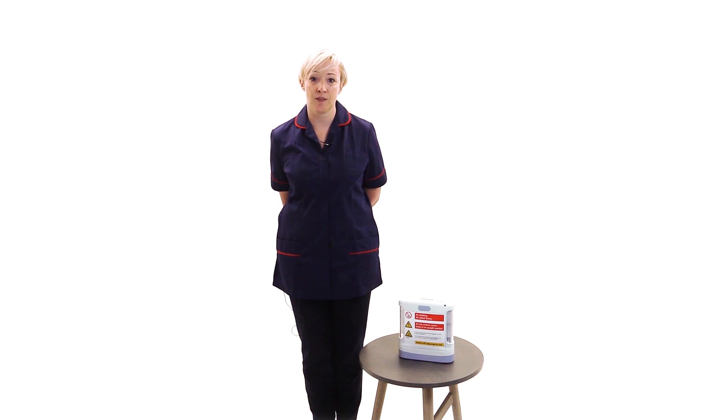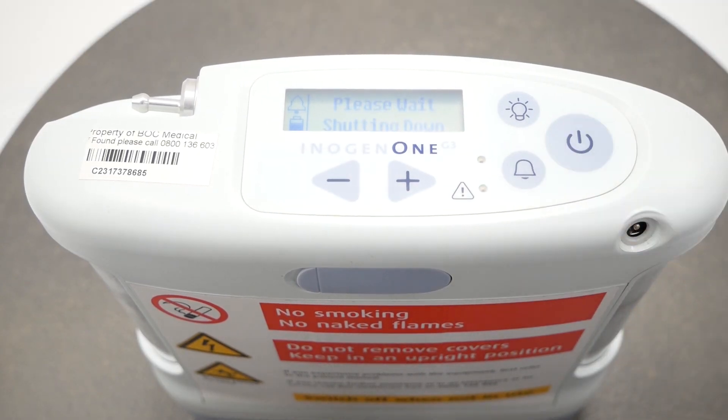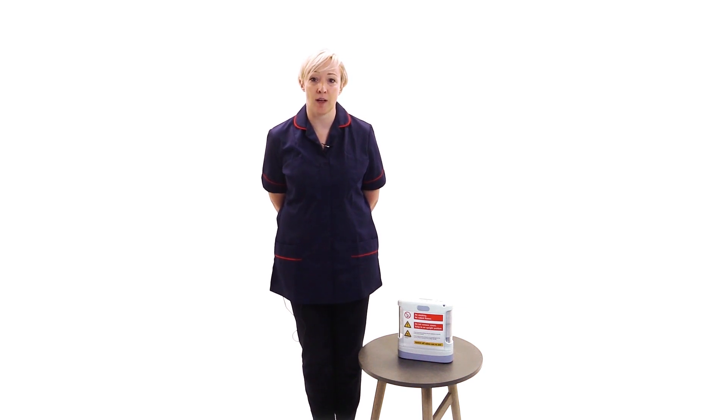When you have finished with the device, press and hold the on-off button for approximately one second. When you are out and about, the device will operate from battery power which will discharge over time. You will therefore need to monitor the battery status and keep it charged as required.